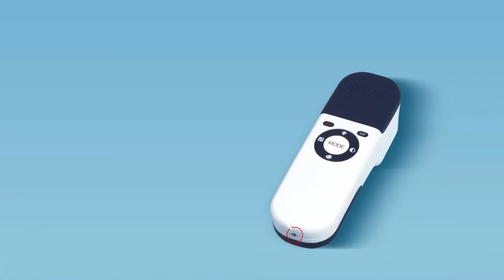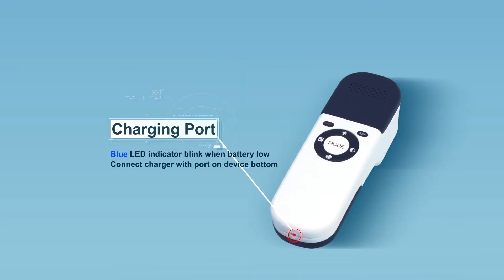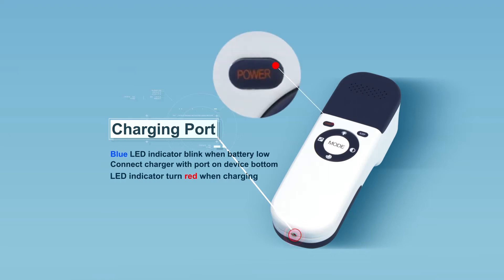The blue LED indicator on the power button will blink when the battery is low. To charge VeinFinder, connect the charger with AC power and insert the charging cable into the port on the device. The indicator turns red while charging, and turns green when the battery is fully charged.